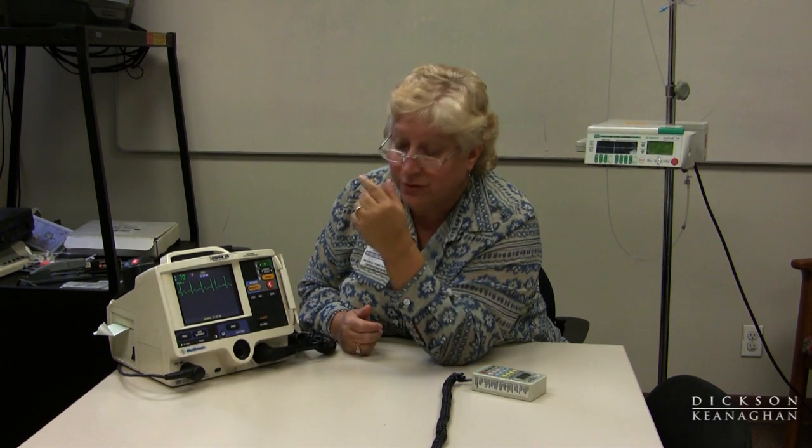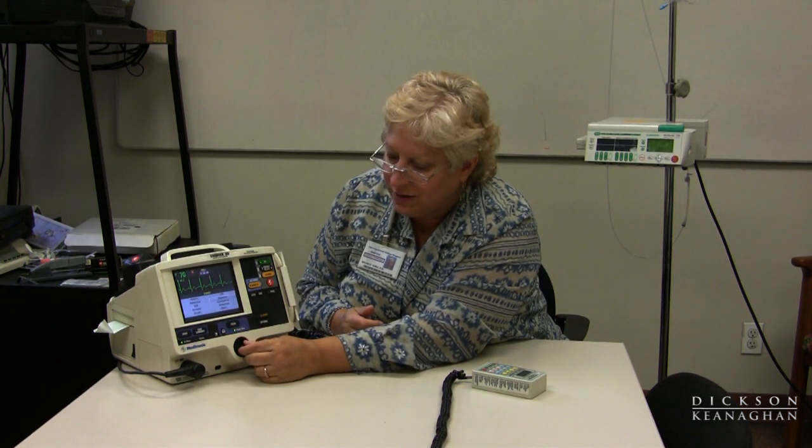If there's an event occurring, such as a code, I can press the event button and it enables me to log items using the menu during a code. For example, if I've given a patient atropine right this minute, I'll press atropine and it will store that information at that time. Pressing event again lets me go through CPR and other drugs. I can press more to get additional drugs including amiodarone, lidocaine, and even TPA, as well as transport. Most facilities use a code sheet to document this, but this is a way to document events at the time they happen.